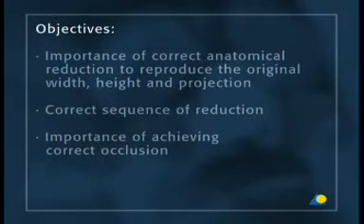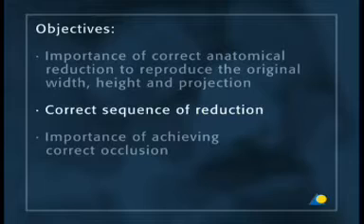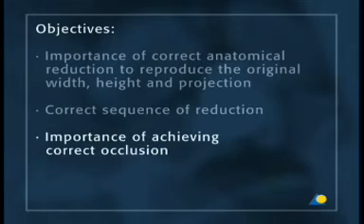The objectives of the exercise are to understand the importance of correct anatomical reduction of the facial buttresses to reproduce the original width, height, and projection of the midface, the correct sequence of reduction of the multifragmental midface fractures, including the orbit, and the importance of achieving correct occlusion.